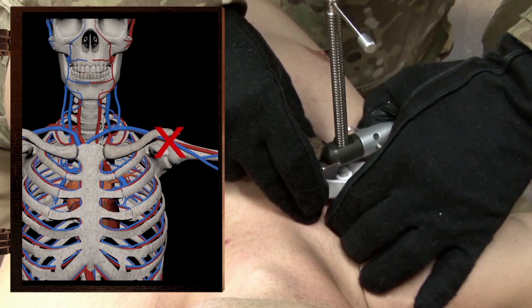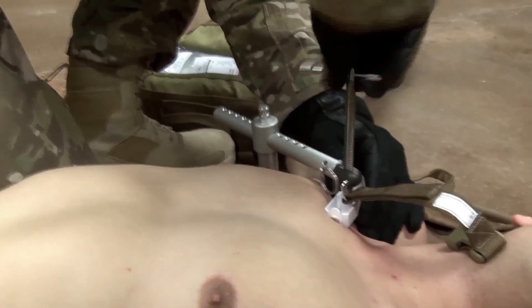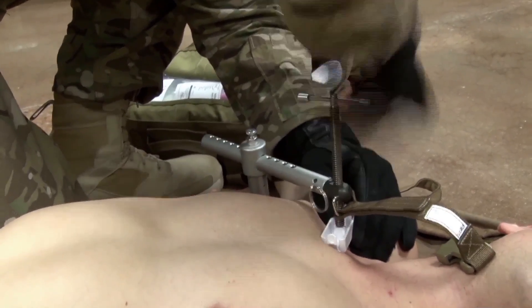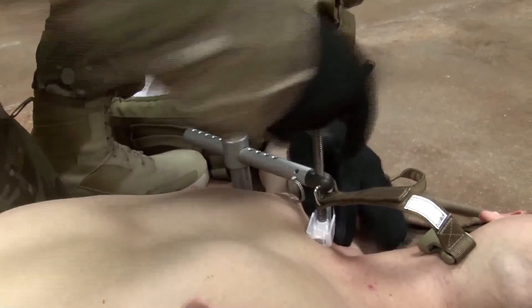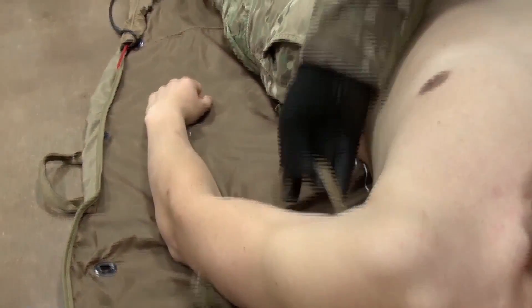The pressure disc should not make contact with the clavicle. Apply pressure by turning the T-handle clockwise until the bleeding stops. If hemostasis is not achieved within 20 full turns of the Croc, consider releasing and repositioning the pressure disc. Route the securing strap underneath the uninjured arm and attach the clasp. Write the time of application on the label.